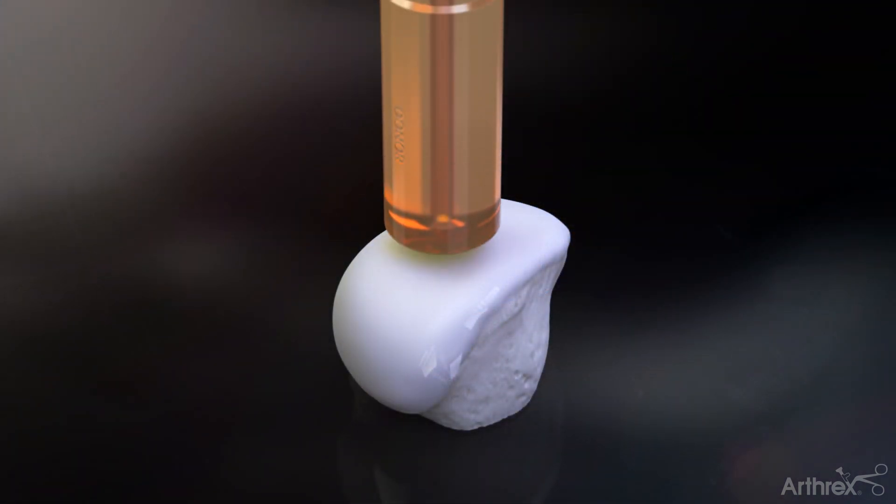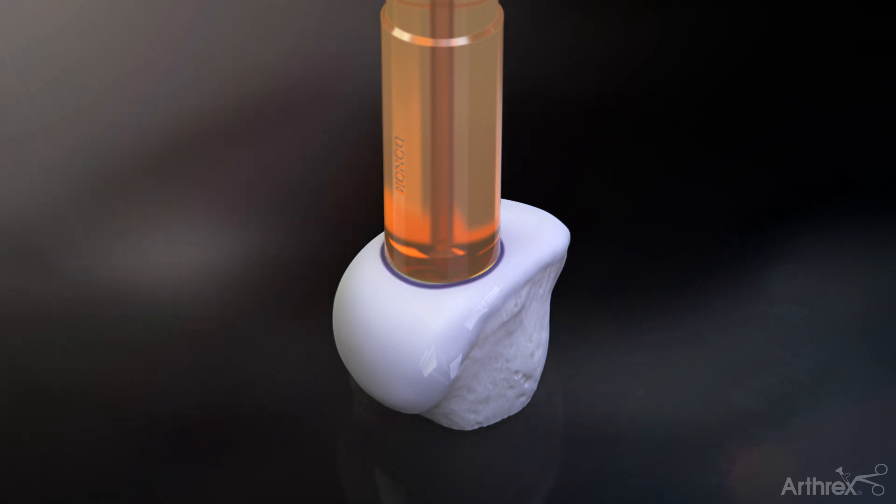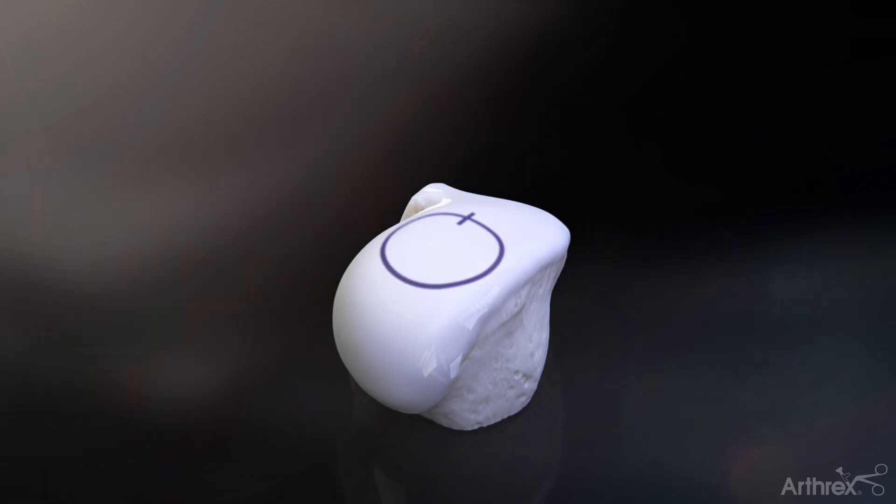Place the sizer used to establish the recipient defect size over the allograft condyle to ensure the allograft is large enough for the defect site. Then, mark it circumferentially and add a reference mark in a superior 12 o'clock position.